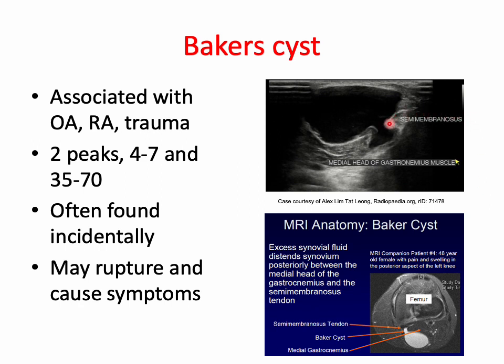Nicely seen on ultrasound. We see, between the semimembranosus and the medial head of gastroc, this fluid-filled anechoic to hypoechoic lesion, smoothly marginated, consistent with a Baker's cyst.